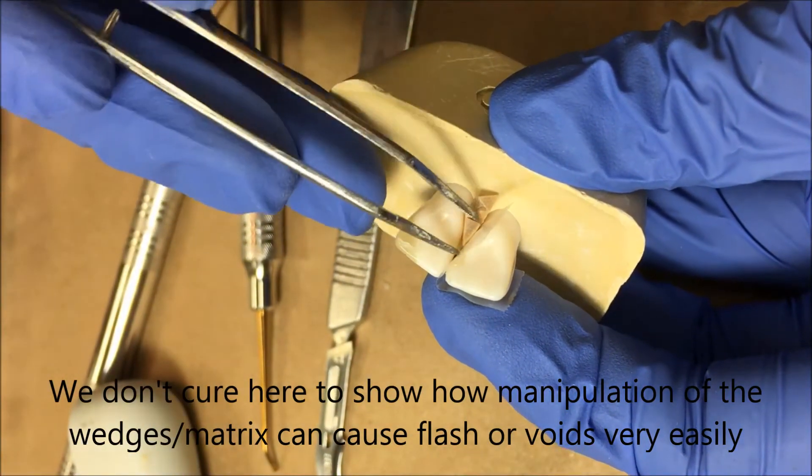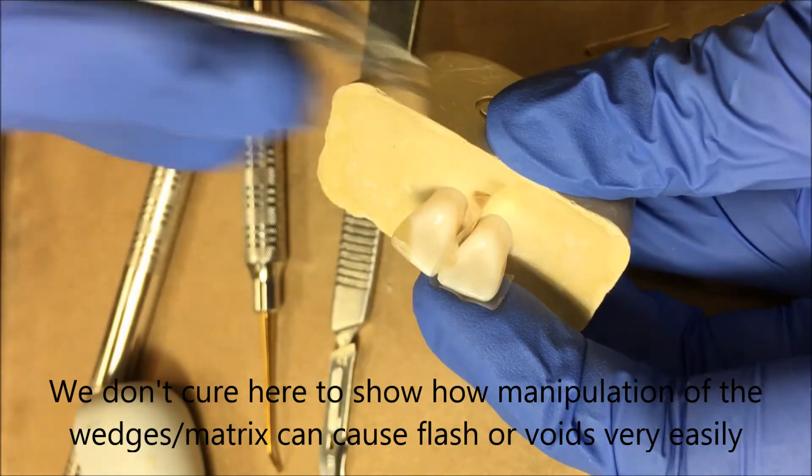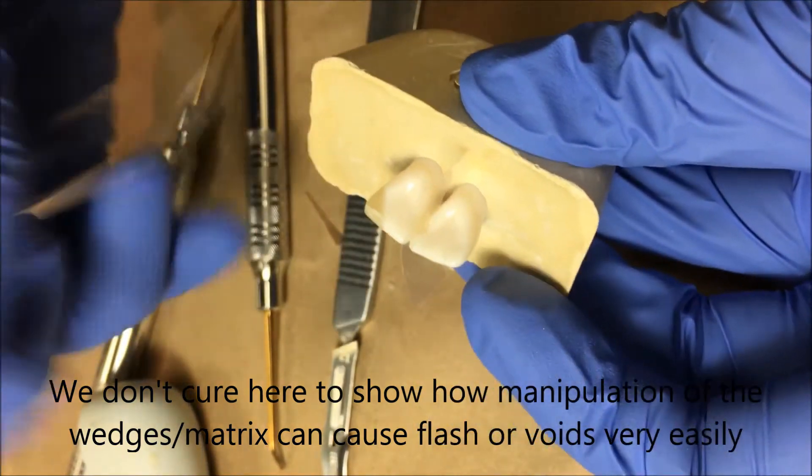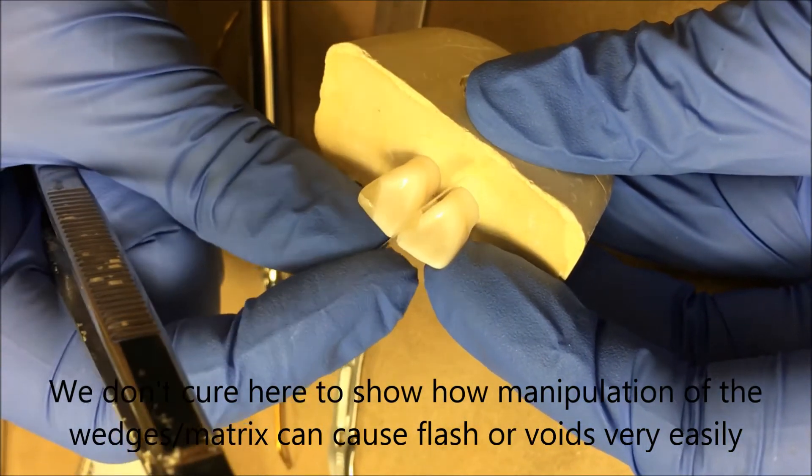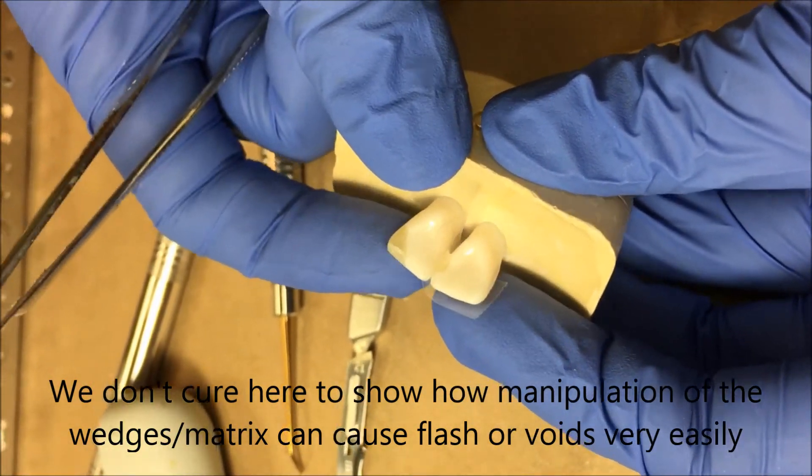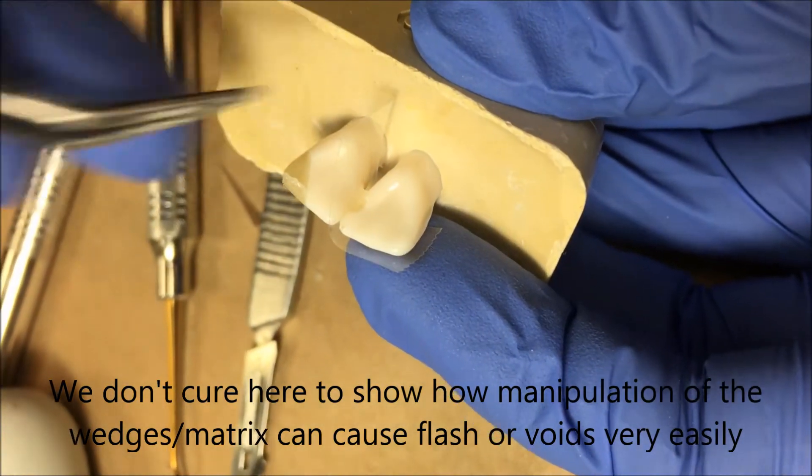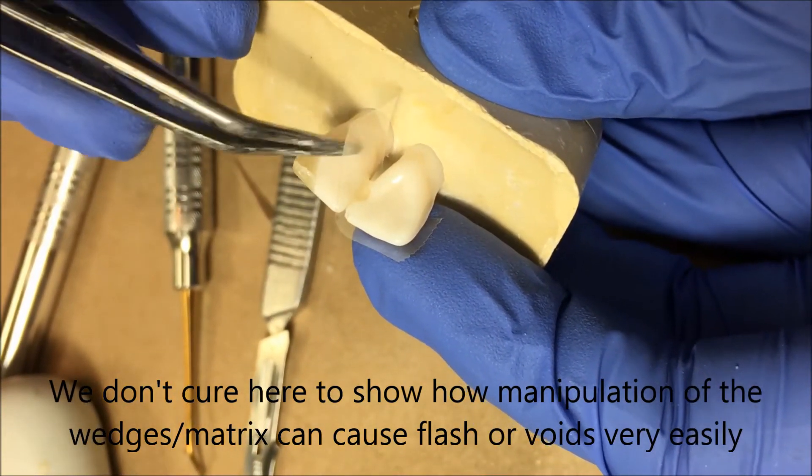At the point that I'm done of course my wedges come out. I don't know if this is going to pull or not or if it'll stay there. It might since it's not hard. A lot of you have asked me why it sticks. Try not to move this around a ton when it hasn't been cured yet because yes look see how that's sticking it's pulling away from it.